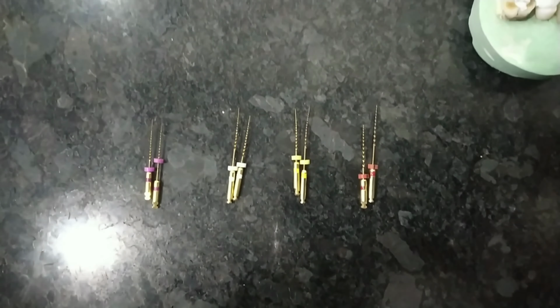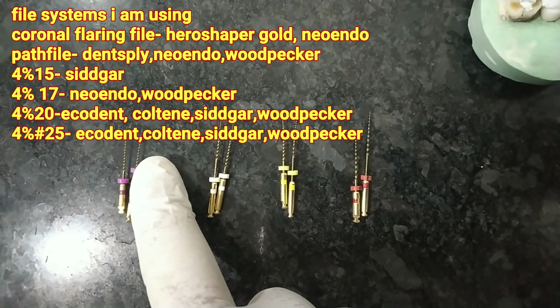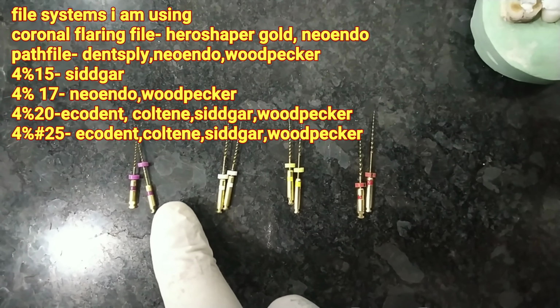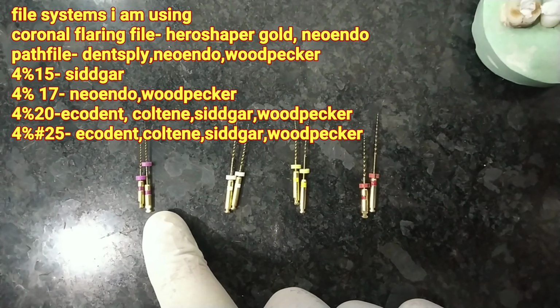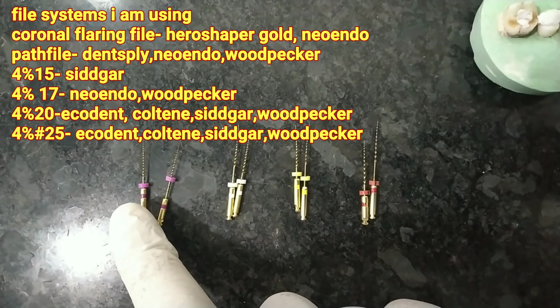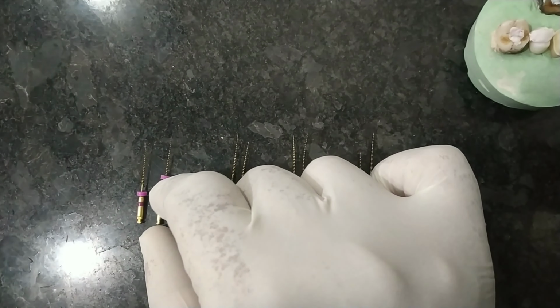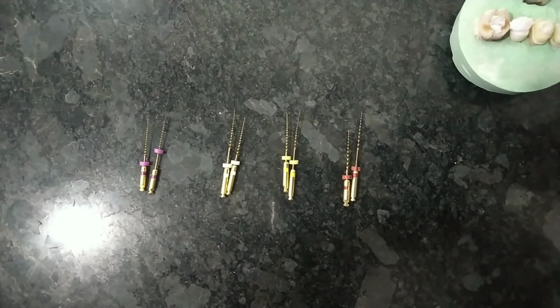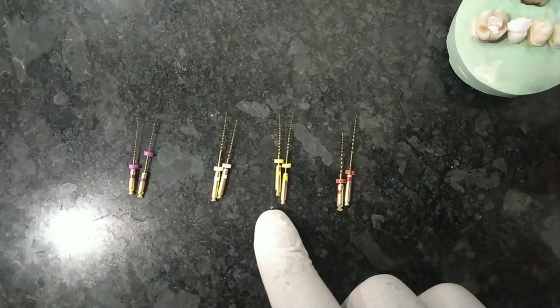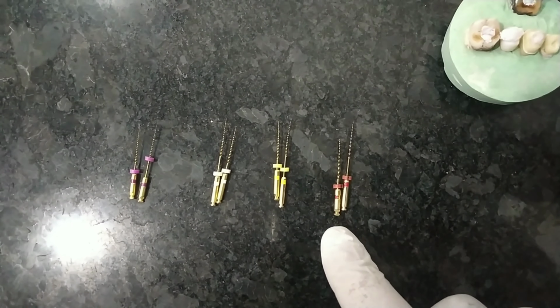So these are the file systems which I am using. This is a variable taper path file from Woodpecker. You can see two files are there. One file is 21 mm, the other file is 25 mm. Sometimes the canine can be very long, so we can get files as long as 31 mm also. If the working length of the tooth is 19 mm, you can use a 21 mm file. If the working length of the tooth is more than 23 or 24, you can use this 25 mm file. This is a path file which is variable taper, and about taper I have already discussed. This is a 4% 15 file, this is a 4% 20 file, this is a 4% 25 file. I usually extend my canals till 4% 25.